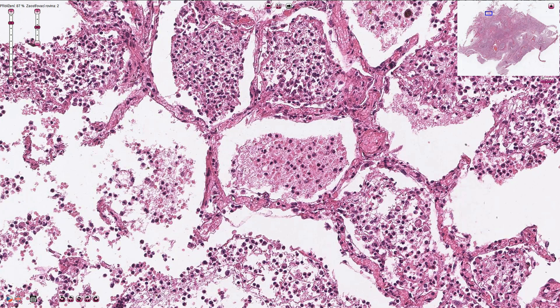We can differentiate two types of pneumocytes. Type 1 pneumocytes are the flat cells lining the alveoli, and type 2 pneumocytes protrude into the lumen of the alveoli. The job of type 2 pneumocytes is to produce surfactant, which keeps the alveoli open and prevents them from collapsing.